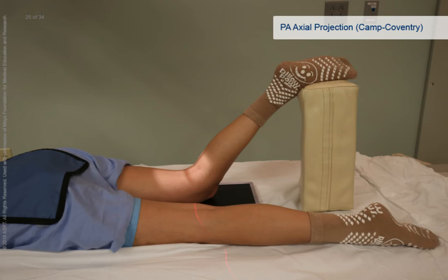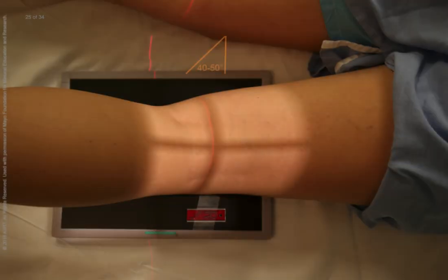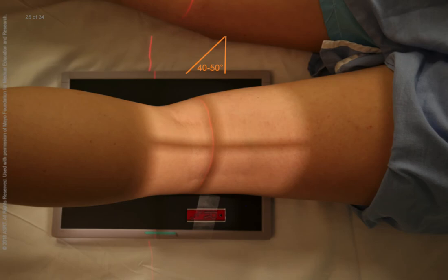Positioning for a PA axial projection using the Camp Coventry method begins with the patient prone and the image receptor positioned underneath the affected knee. Using a protractor for guidance, flex the affected knee until the leg forms a 40 or 50 degree angle with the plane of the image receptor. Rest the patient's foot on a support device and make sure the leg is not rotated. Adjust the position of the image receptor to center its upper half to the knee joint. The central ray is angled 40 or 50 degrees caudad depending on the degree of knee flexion until it is perpendicular to the long axis of the tibia, entering at the level of the popliteal fossa and exiting through the apex of the patella.